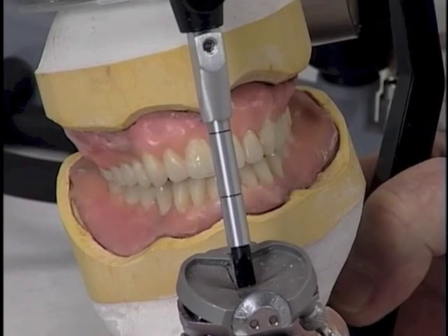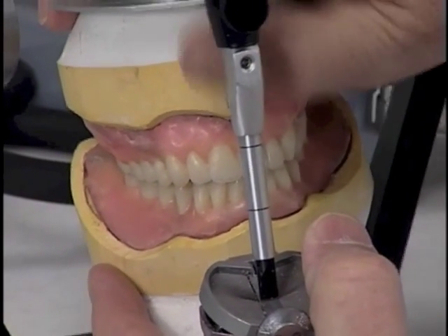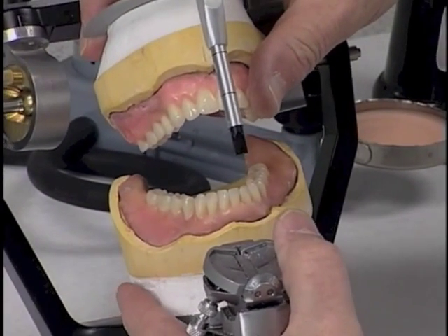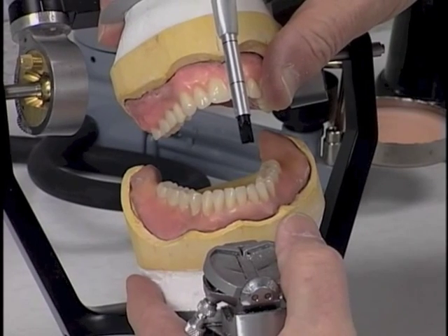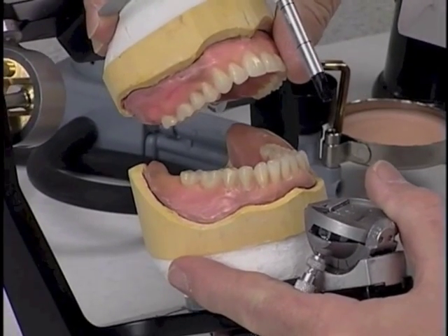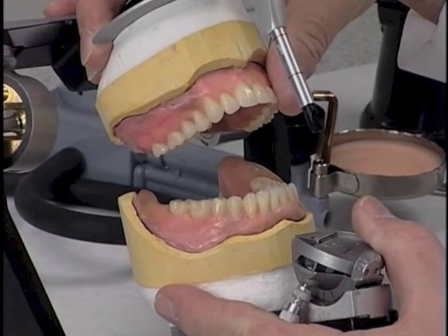Now that we have all of the posterior teeth arranged, we can see that when we open the articulator a little bit, the posterior teeth are set into a curvature. That's a buccal lingual curvature, or curve of Wilson, and an anterior posterior curvature, which is commonly known as the curve of Spee.